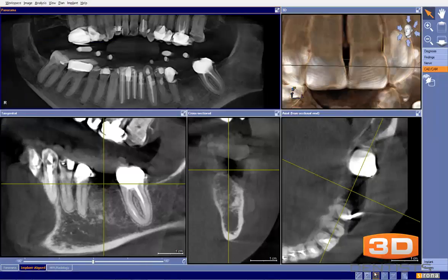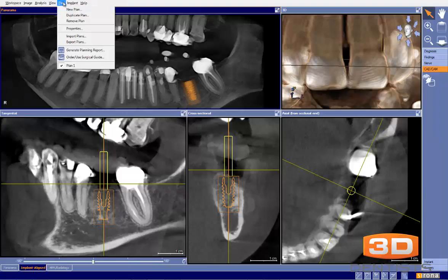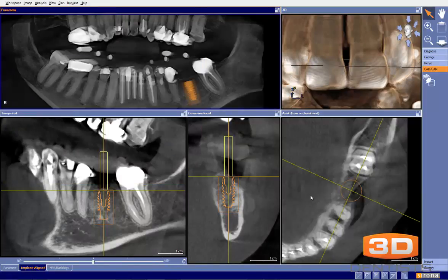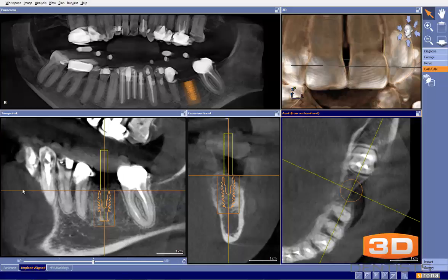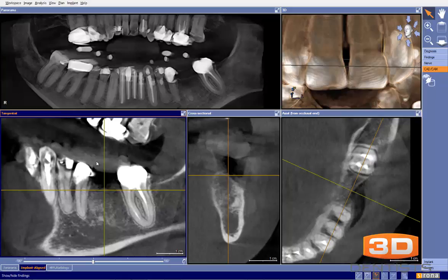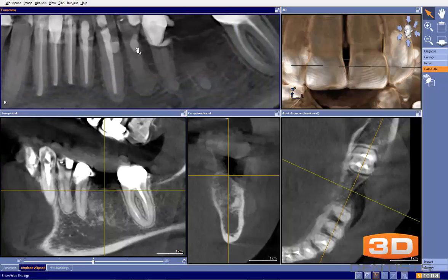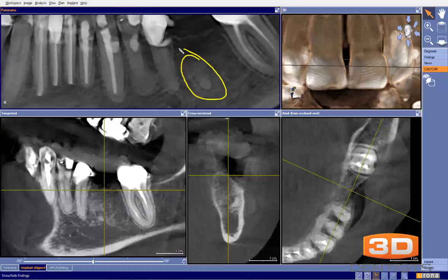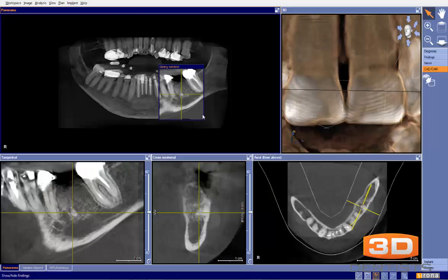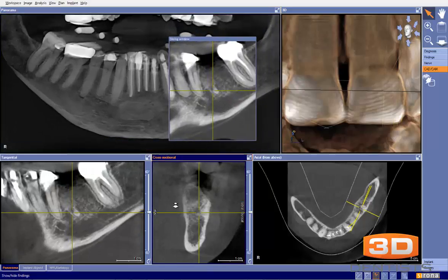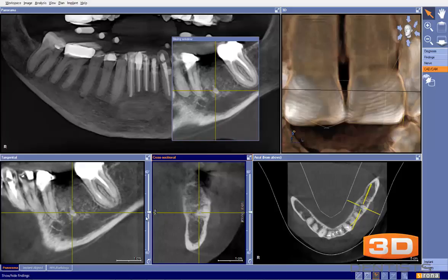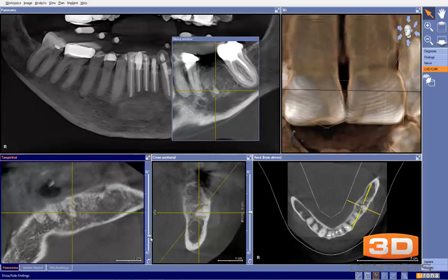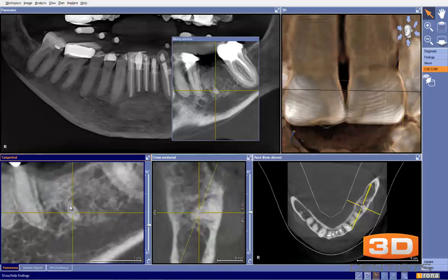Let's start by taking a look at this submitted implant plan. I'd like to go ahead and duplicate this so we can compare and go through our checklist. Let's take a look at what we see on the Panorex version here. We do see a retained root right here, so we know that needs to be removed, and it provides a slight complication to our implant placement. Let's take a closer look — in the 3D view we can double-click and see the root right there.